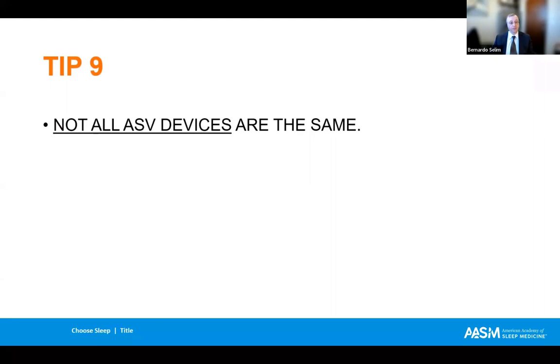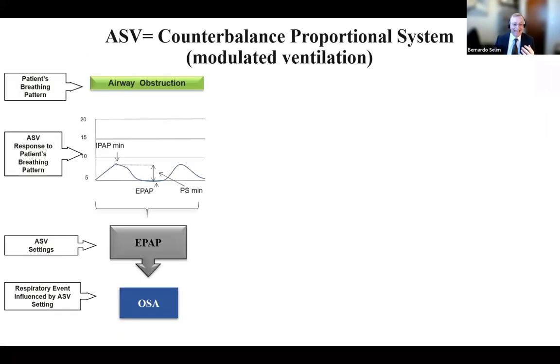Tip number 9: not all ASV devices are the same. How many times has your lab, your patient, or your clinic contacted you to say that a patient who has been titrated on one ASV device, one of the brands, happens to receive another one from the DME and says, oh, I don't feel the same. I feel that this device is not helping me. It can happen. So let's go to the basics.